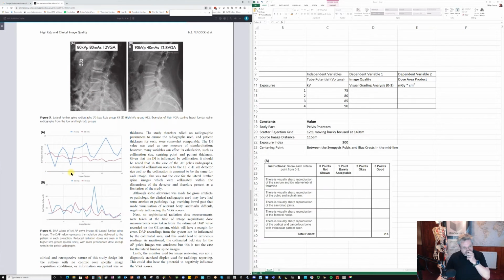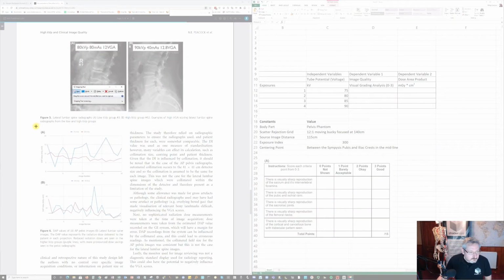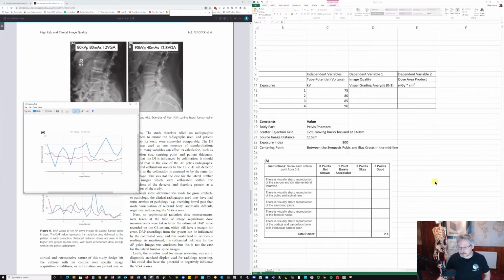So we're going to be able to do that in bar graphs because we're not going to have this spread along the bottom axis here. What I'll do is I'll just take a grab of these, even though we're not going to replicate them entirely the same. So we're going to have 4 on our, so that's going to be the results for dose. And again, we'll make that a lot smaller.